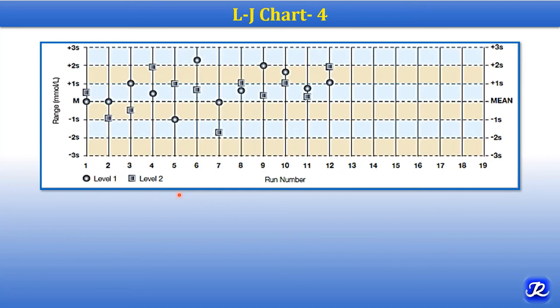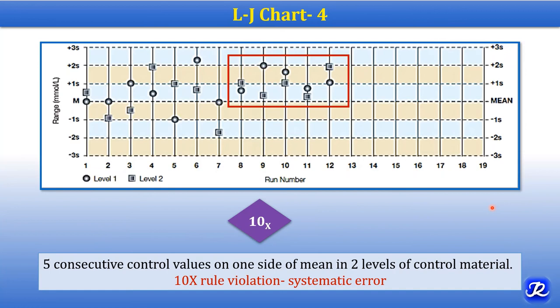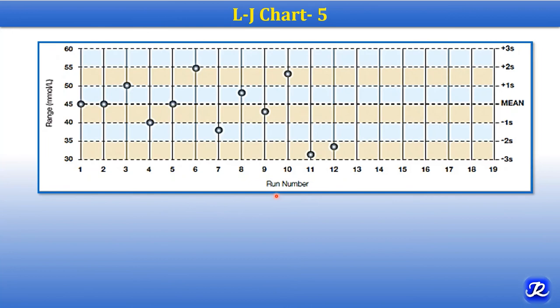In this LJ chart, two levels of control material are used and control measurement values are plotted. From the eighth run, all the control values are on one side of the mean, and there are 10 control measurements total. It is violating the 10X rule because there are 5 consecutive control values on one side of the mean in two levels of control material. This is a 10X rule violation showing systematic error.